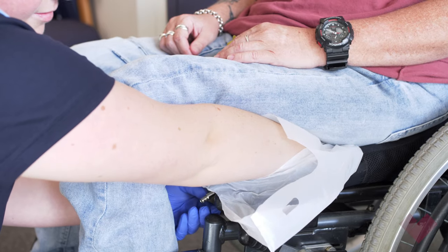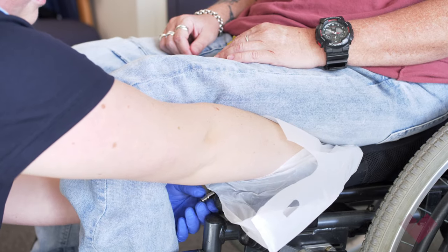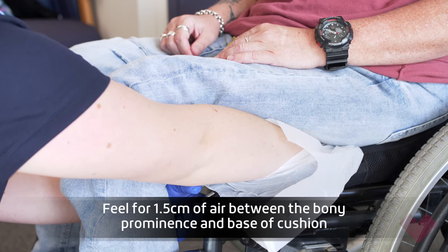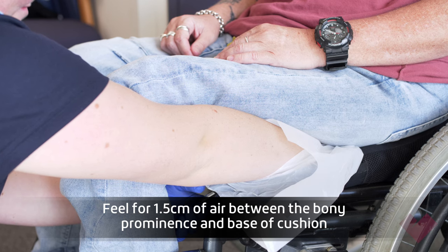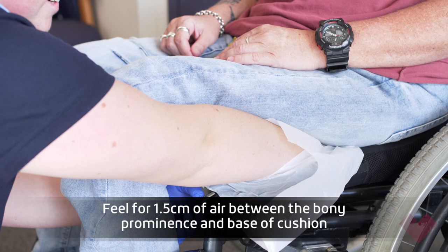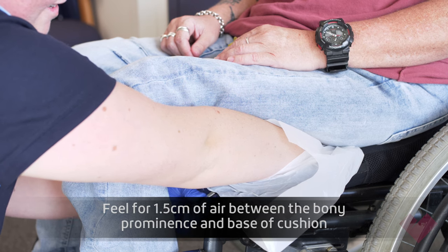As the air is leaving, the person will start to sink into the cushion. You are feeling for approximately 1.5 cm of air between the person's ischial tuberosity and the base of the cushion. Turn the air valve to the right to close.